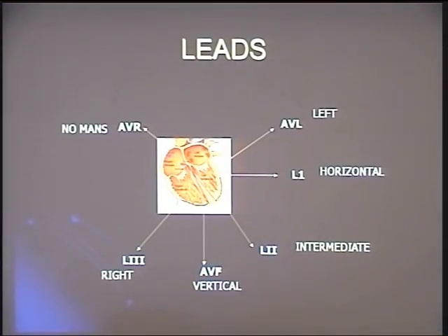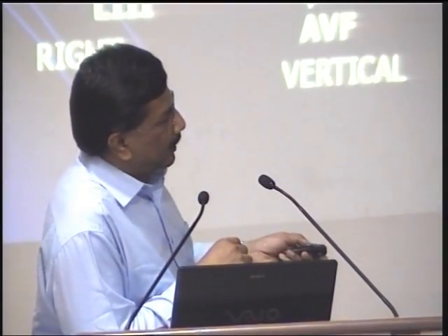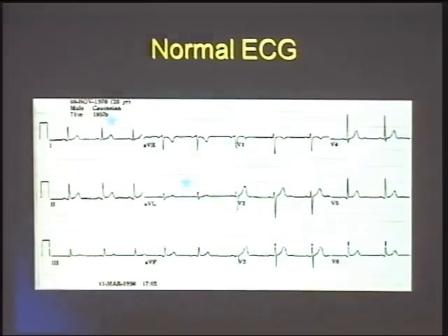Because as you know, the atrial depolarization, the ventricular depolarization and the repolarization are going to go away from lead AVR. So not only have I understood the surface, I have understood the coronary artery perfusion, now I have understood each one of the leads in relation to the various surfaces of my heart. Is that clear? So you have to remember this. This diagram is very important to understand the axis subsequently. L1, L2, L3, AVF, all the 6 leads.